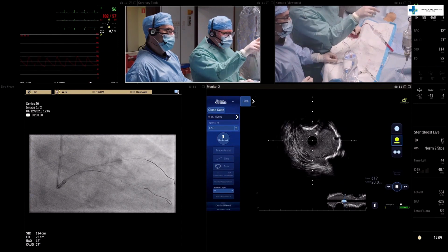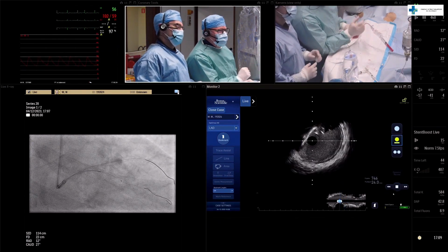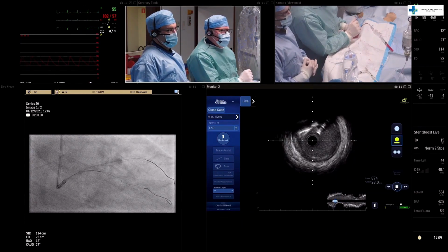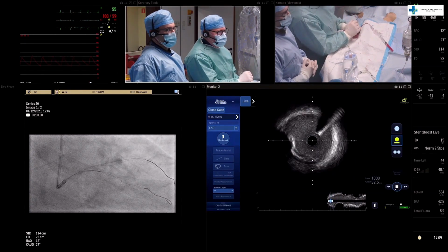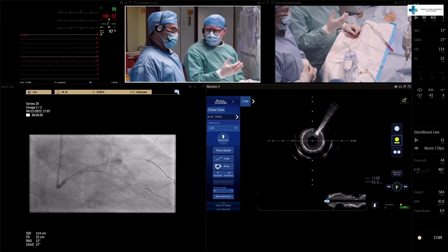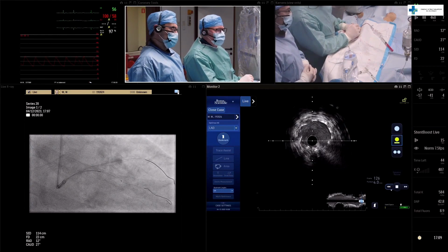You see some calcium cracks there, and especially in the distal left main. You see this is after low pressure balloon dilatation, and now the lumen is much bigger. We prepared the calcium. We achieved calcium cracks with intravascular lithotripsy, so it was, I believe, very effective.